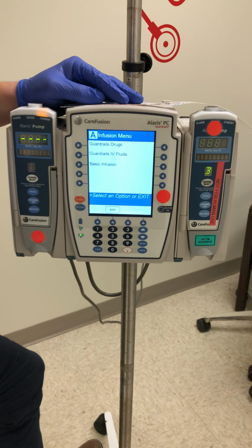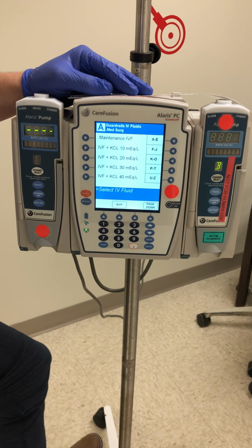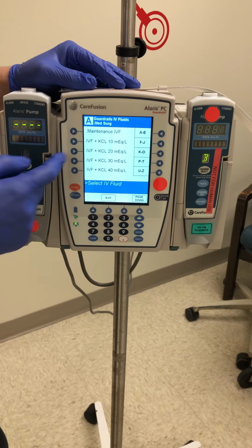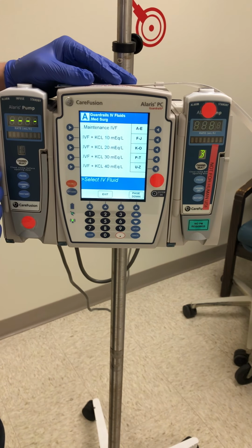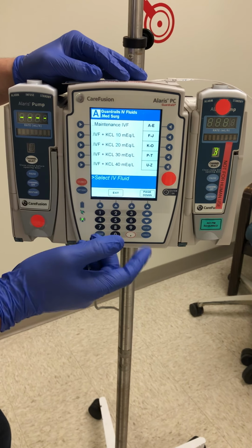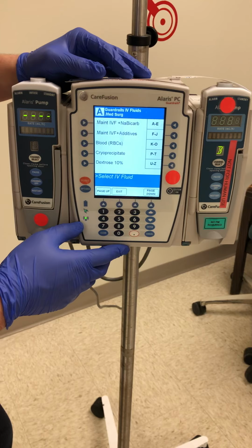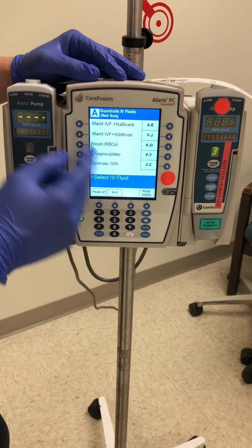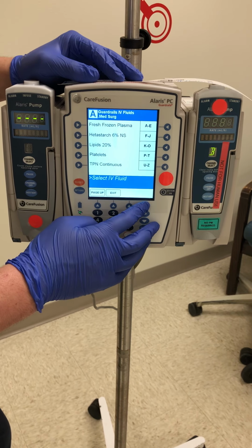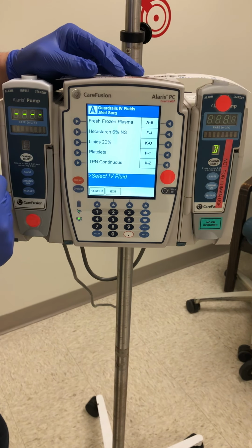So to hang primary fluids, we're going to press guardrail IV fluids, and a menu pops up with some different options. So we have just normal maintenance fluid we can select, and then you notice some options below with some different additives such as potassium. If I scroll down, bicarbonate, and this is also where we would administer blood products, dextrose, lipids, TPN that we've learned about, and so on and so forth.